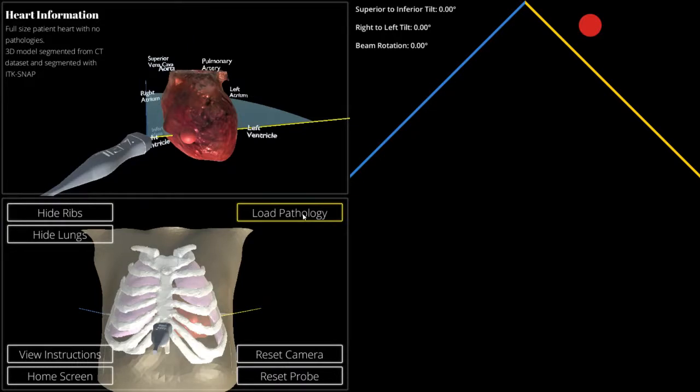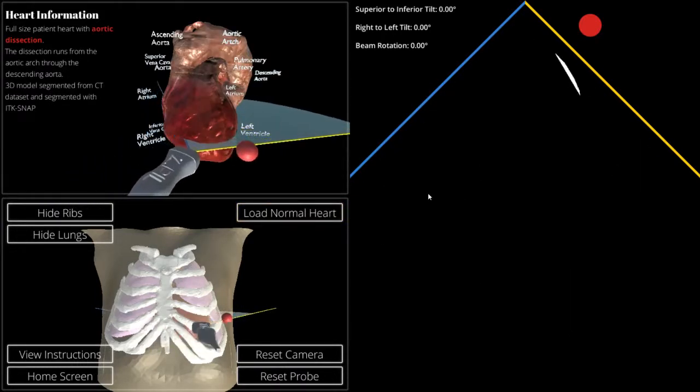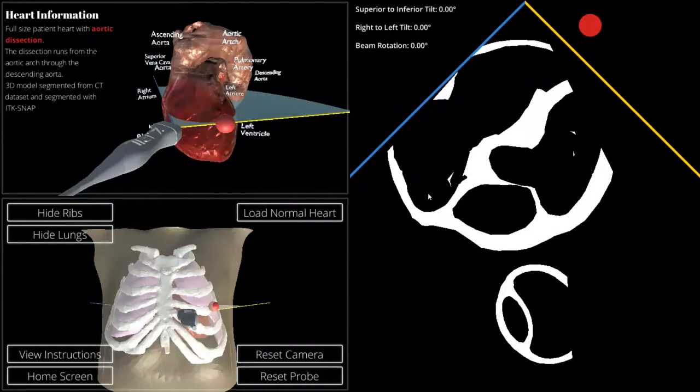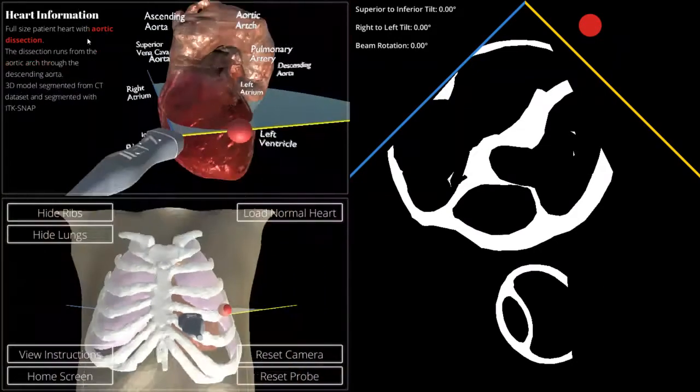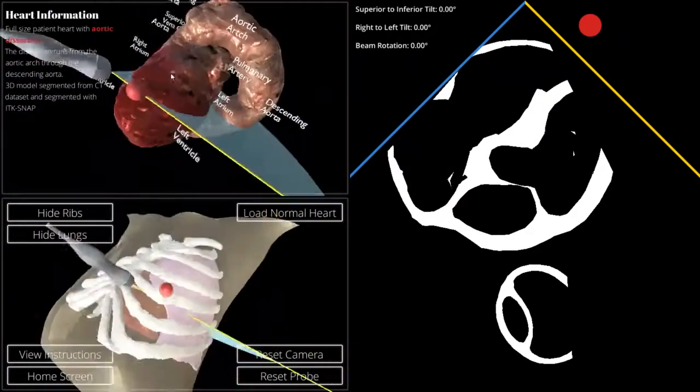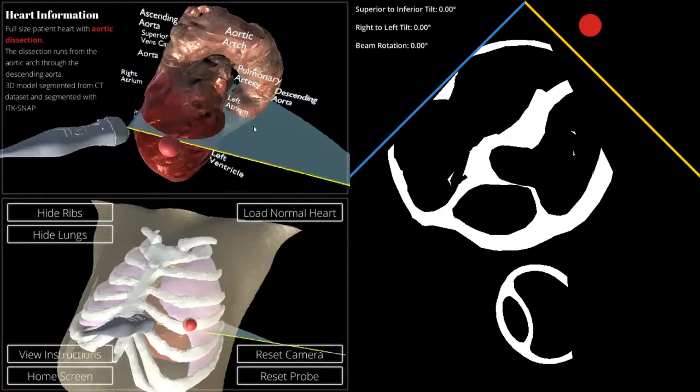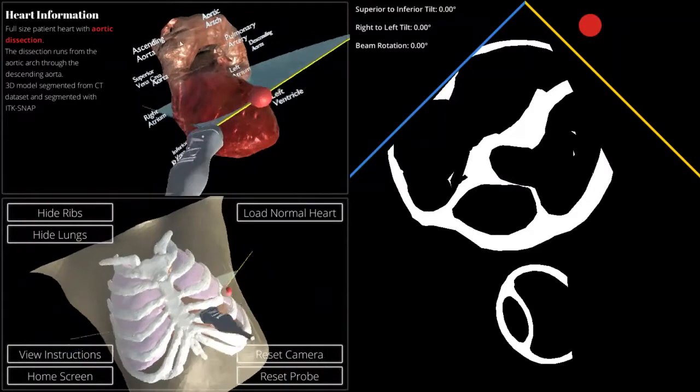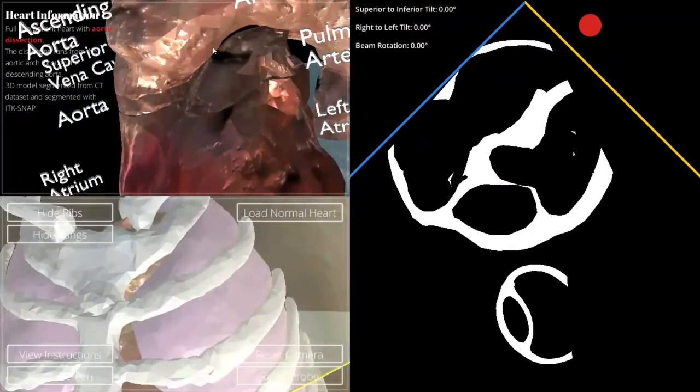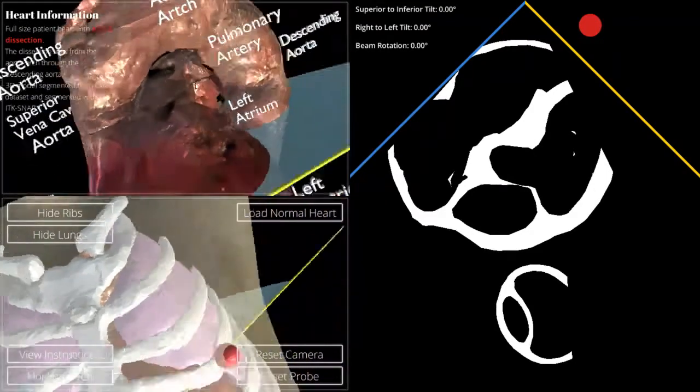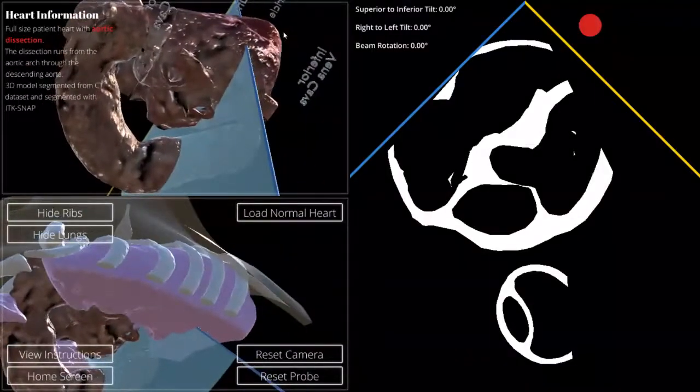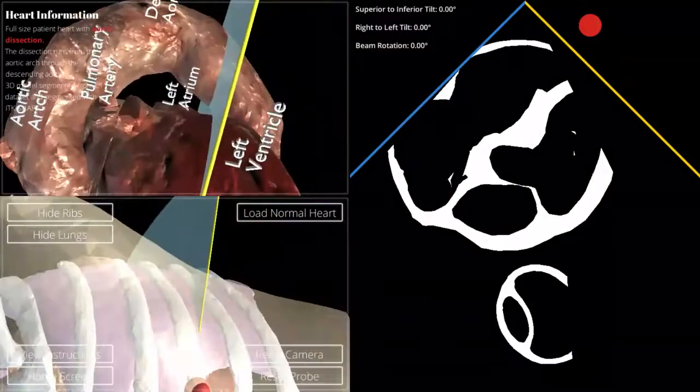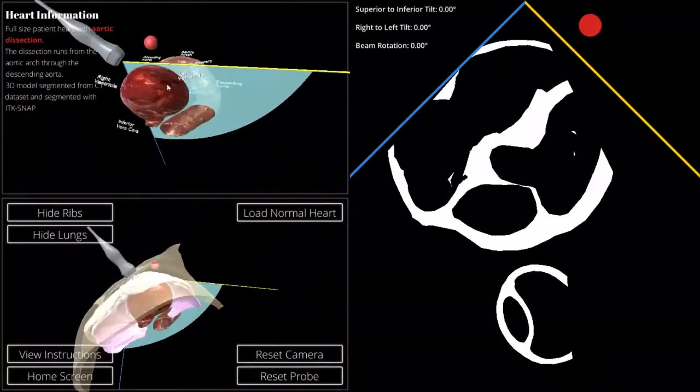The other feature that we built in is the ability to load different pathologies. In this case, we are loading the heart with an aortic dissection. As you can see, it is the full arch this time, just to showcase the aortic dissection. And the labels change as such too, so that you can see the ascending aorta, the aortic arch over here, and the descending aorta.